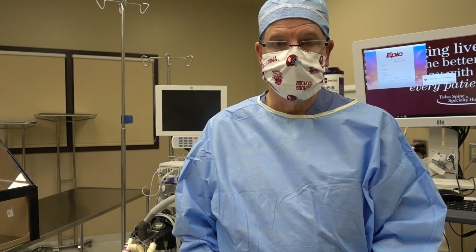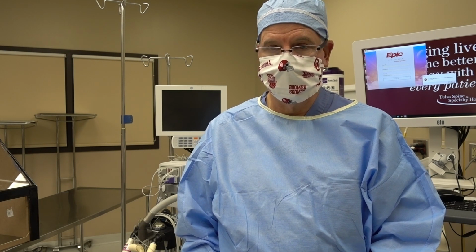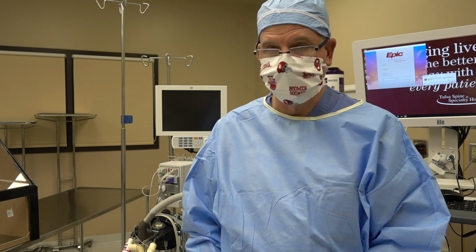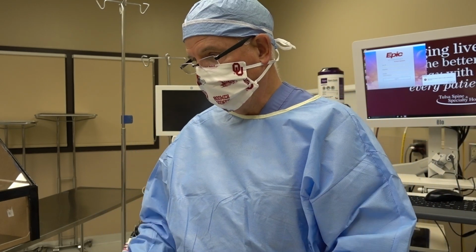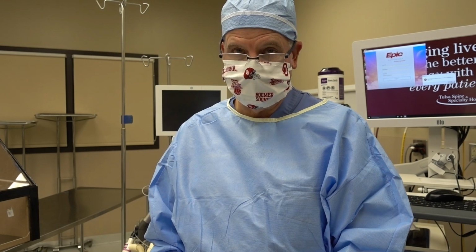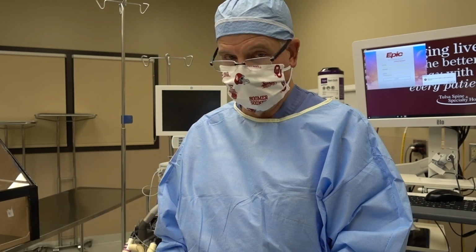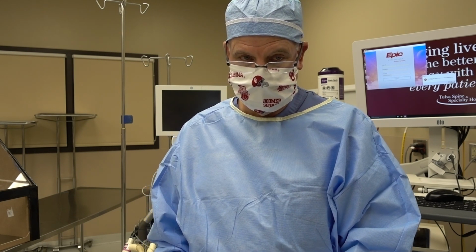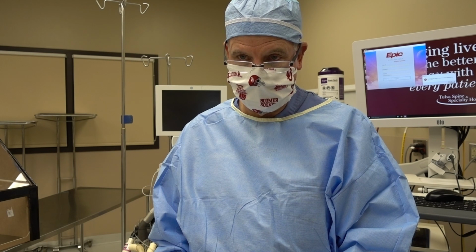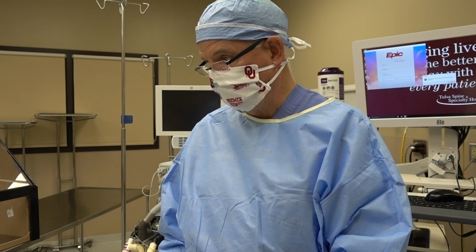First I'm going to show you the retaining rings and go over exactly how to put them in. It's quite easy. I've designed this so anyone could probably have this put together within a week. It's very inexpensive to operate. It's got two-sided bags that are quite strong that will keep the aerosol inside the chamber.